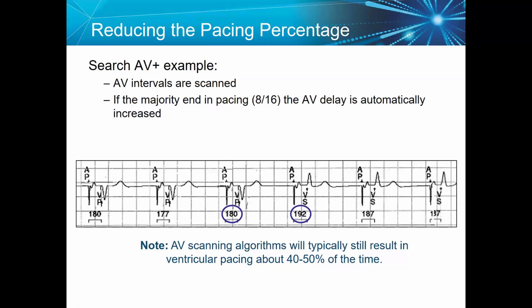So our aim is to promote and improve intrinsic conduction and make the pacemaker a backup for pacing if intrinsic conduction is not present.